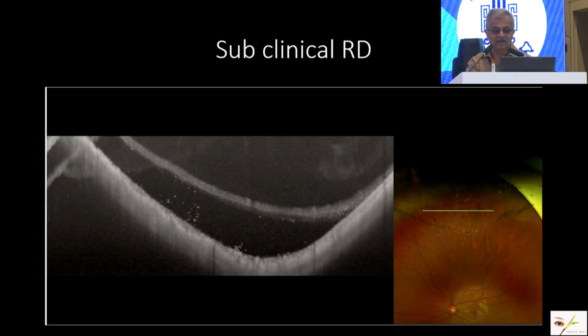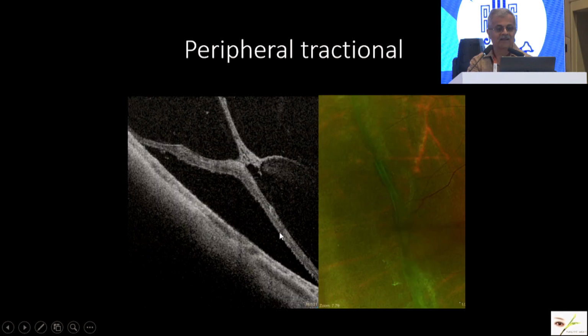This is a subclinical RD, how it would appear. And this is a peripheral tractional detachment. You can see the traction here.